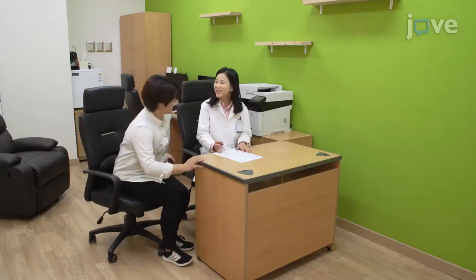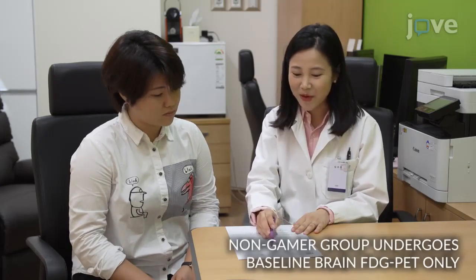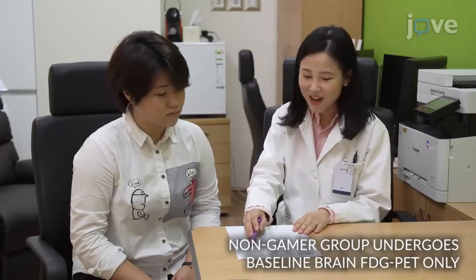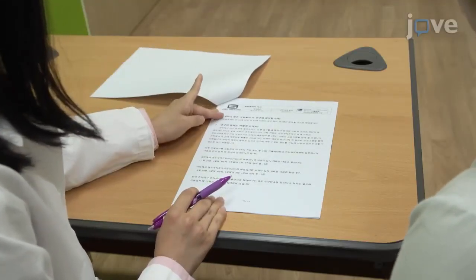After recruiting both online game playing and non-online game playing individuals, explain to each participant the aim of the study, the main experimental procedures, and any potential risks associated with participating in the study. After answering any questions, obtain written consent.